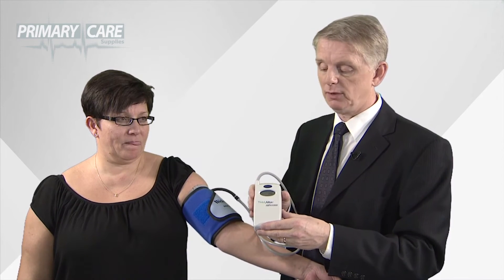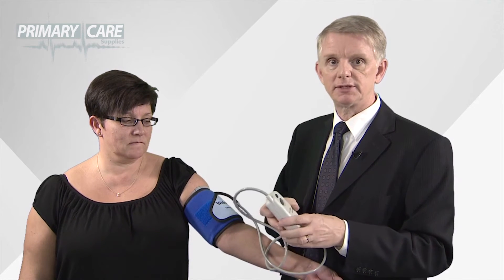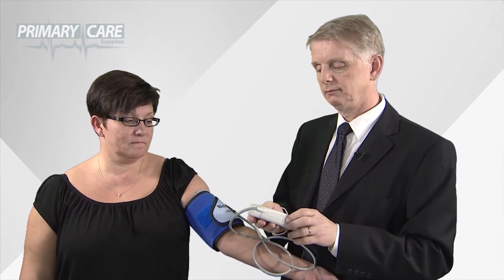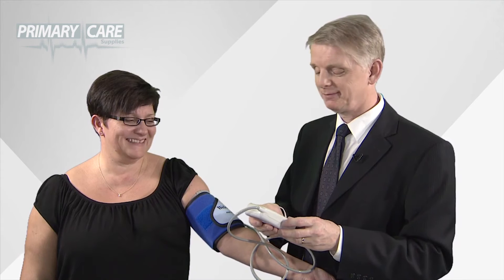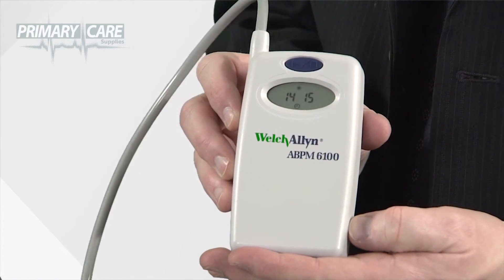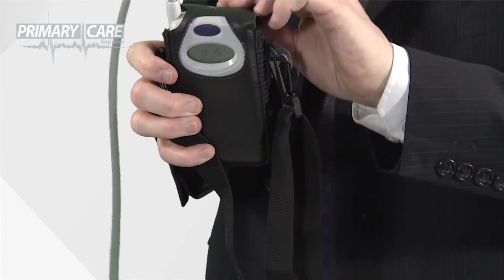The ABP takes a test reading which you'll be able to see on the display. After that, the patient will only see the time of day, which it takes from the PC. When the unit first inflates the cuff, it'll go to 160 systolic. If it gets a systolic reading below that, that's where it'll go next time. If it needs to go above 160, it'll wait a few seconds and try again. Once the reading is taken, the display will show the time and the test is in progress. You can then put the unit into the pouch, worn by the patient using either the shoulder strap or the waist belt.